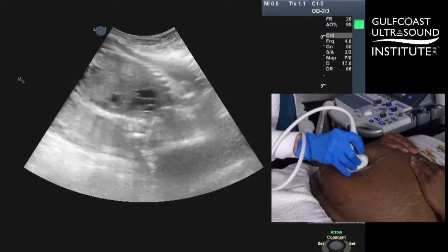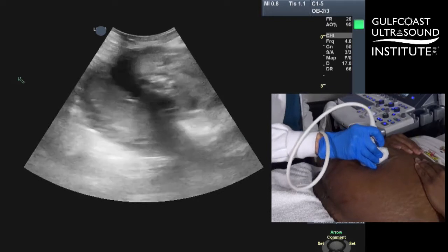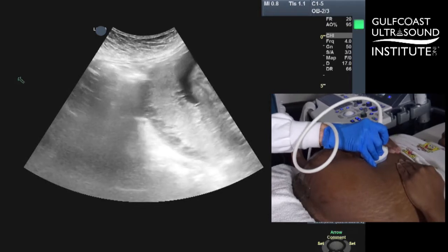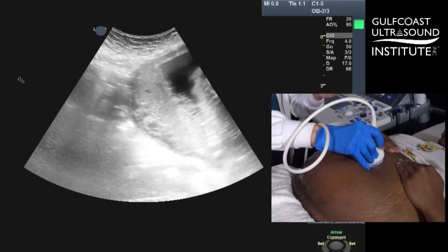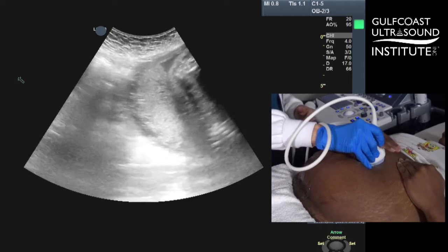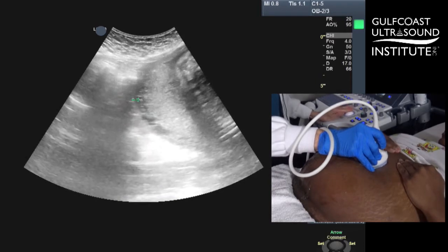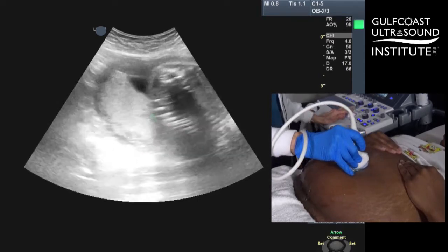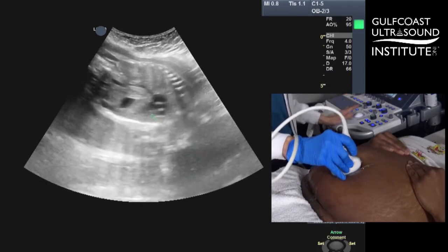You can see the baby's head is low, coming up to the heart with some movement of the fetus, and all the way up towards the top of the uterus. I'm taking a look at mom's abdomen to get an idea where I can divide her abdomen to the top of the uterus into four quadrants. So I'm at the top — you can see placenta, a fundal placenta with a posterior lie, coming back down halfway. I've just divided that longitudinal path into a halfway dimension.